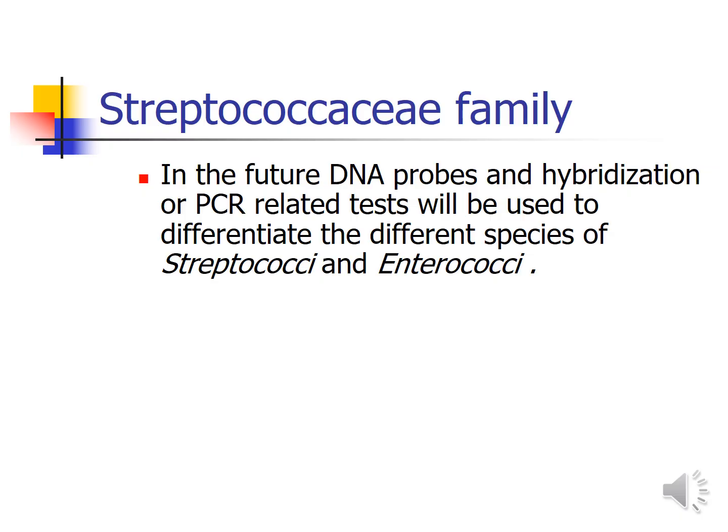In the future, DNA probes and hybridization or PCR-related tests may be used to identify Streptococci and Enterococci. So they may be used for differentiation of these bacteria.